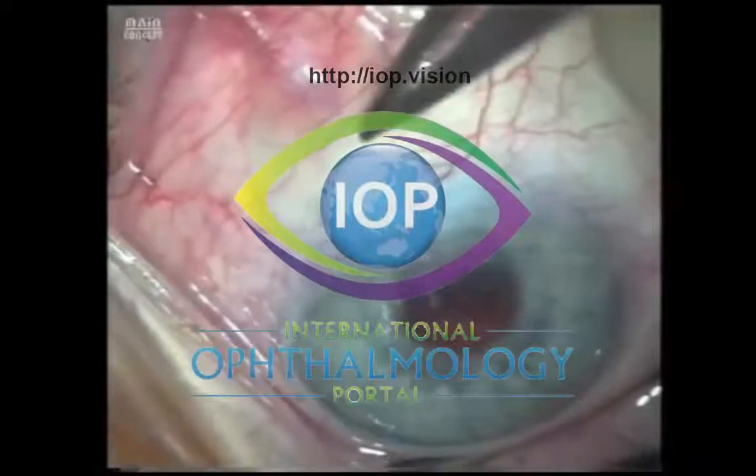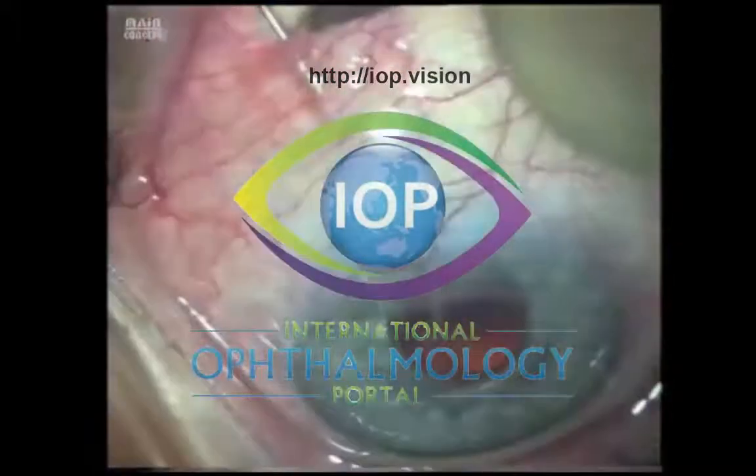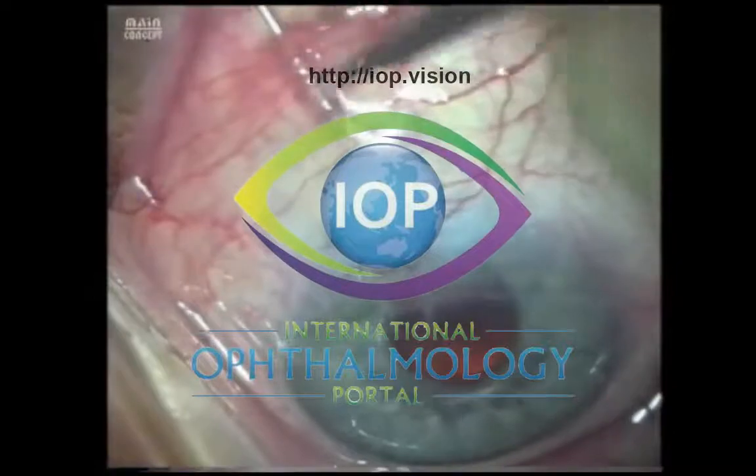The needle tip goes into the subconjunctival space, and it's very important to know exactly where your needle tip is at all times.